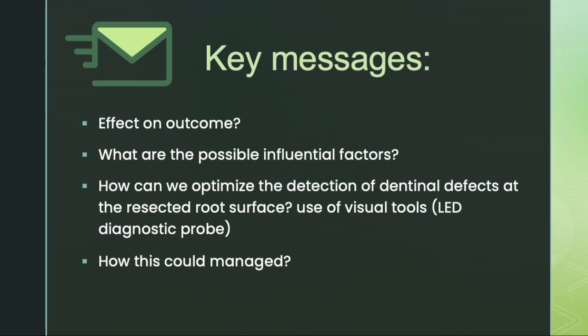The final question is how this could be managed. Since it was observed that the ultrasonic retro prep can propagate these existing defects, from a management point of view, it is suggested that a higher root resection should be considered to eliminate these defects before proceeding with the ultrasonic retro preparation.